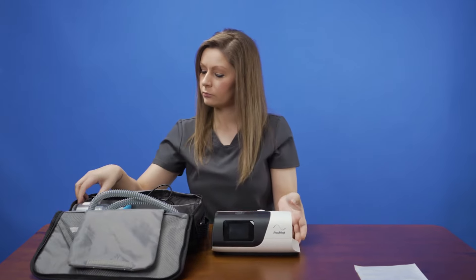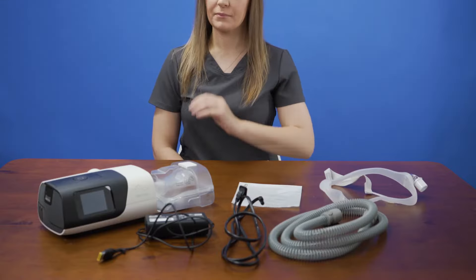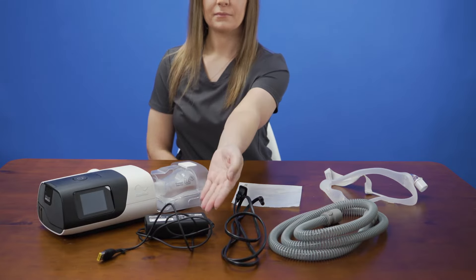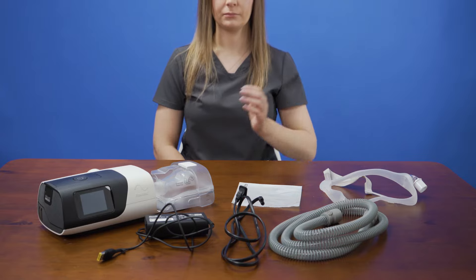To get started, unpack all of the items from the bag. You should have the AirSense 11 device itself, the power supply, tubing, extra filter, and mask. You'll also find the user manual — keep this in a safe place for later use.